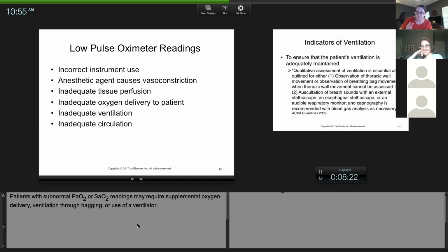Now, someone said they were impressed that it was even 87 to 90 on the floor. Sometimes when it falls off, it doesn't just go to 0. Sometimes it's still at the reading. Sometimes these probes, you put them on the tongue and they start to slide to the tip of the tongue, or all of a sudden they're hanging off the very edge of the lip and they might fall. But that taught me a very important lesson: maybe before I alert my boss to a problem, I should check the probe.